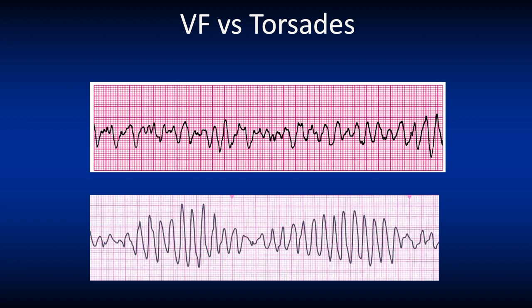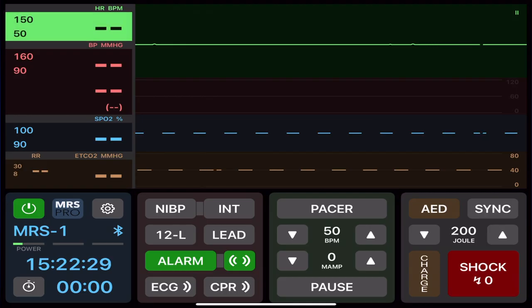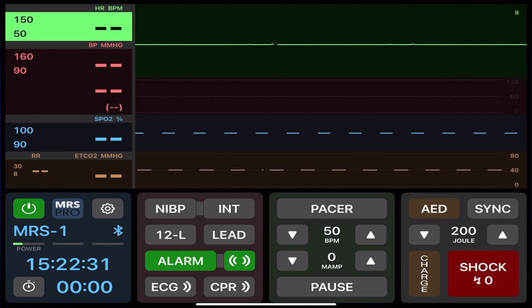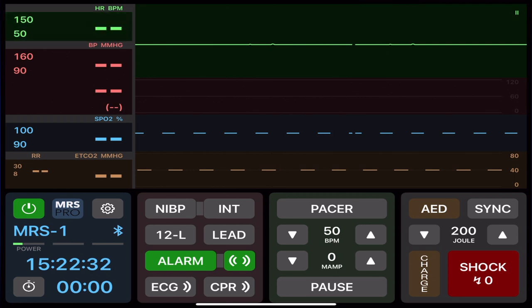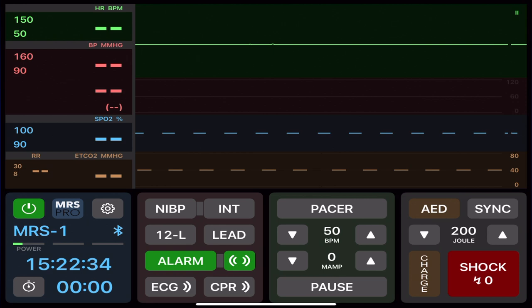Here we see the difference between VF, which is on top — an ECG full of chaos — versus torsades, which is a rhythm with a pattern. Let's have a look at asystole, meaning there is no electrical activity, and this is typically a rhythm we will see at the end of cardiac arrest management.